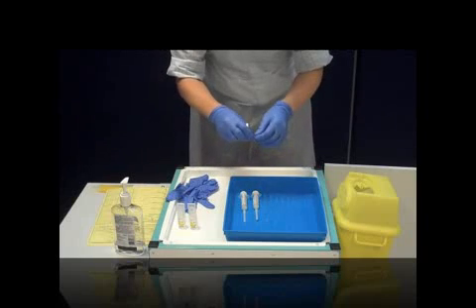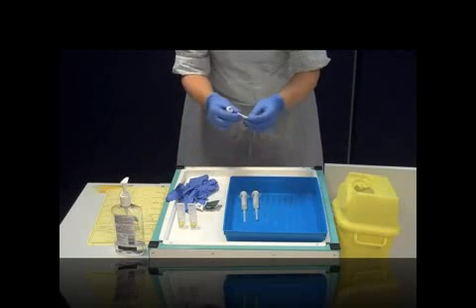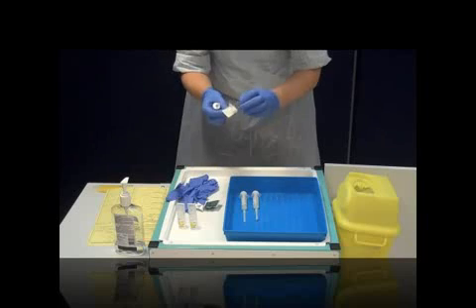Take the top off the antibiotic and give it a clean with one of the ChloraPrep wipes.